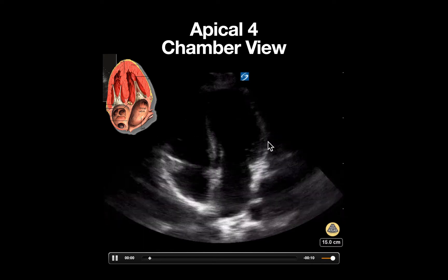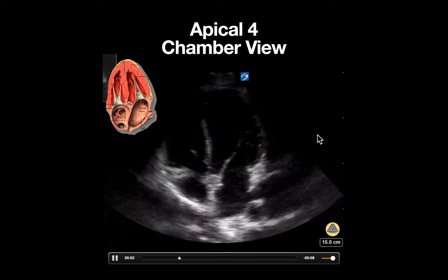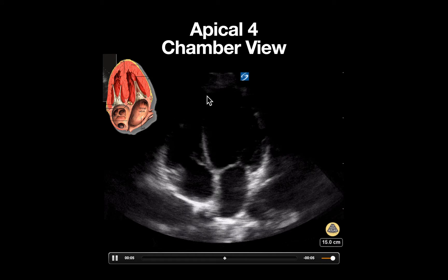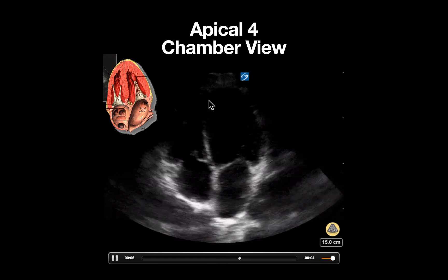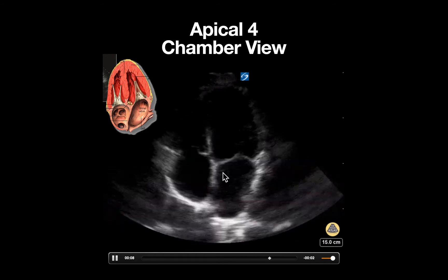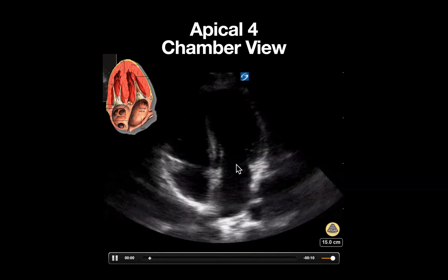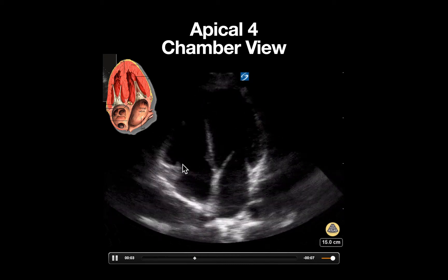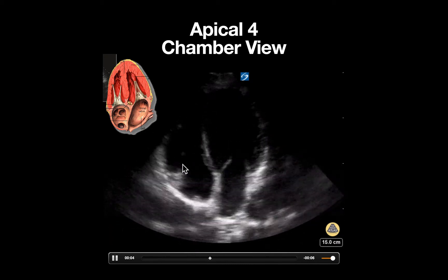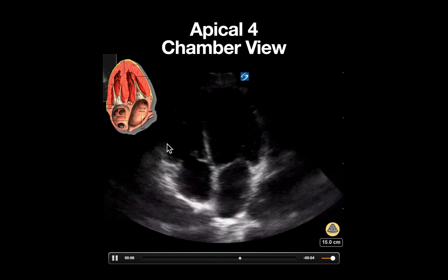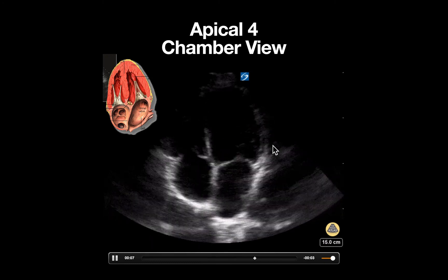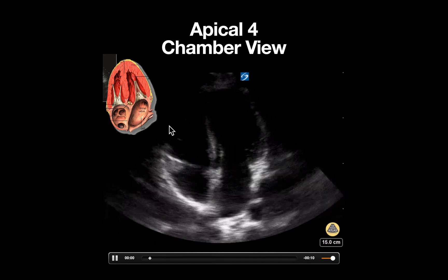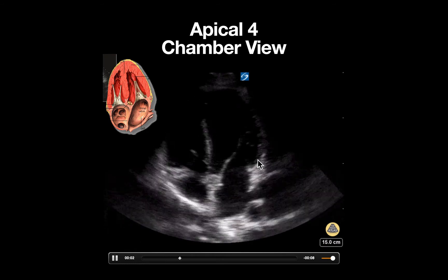A satisfactory apical four chamber view will have the following components as seen here: a septum that's running straight up and down in the middle of the screen, as well as the presence of both mitral valve and tricuspid valve that are clearly seen. You should also be able to see the RV wall and the LV free walls clearly. In this image, the right ventricle free wall is slightly obscured.